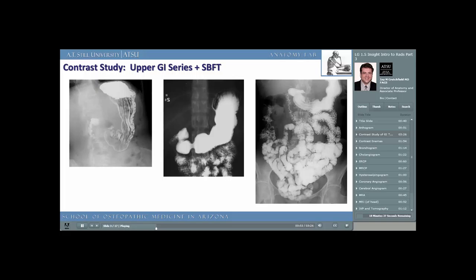Here on the left we can see the stomach and a portion of the duodenum. On the far right, we see an upper GI series with a small bowel follow-through, abbreviated SBFT. In the middle image, an upper GI is demonstrated with not only the stomach and duodenum being seen, but the proximal portions of the small intestine, notably the jejunum. There are several risk factors associated with upper GI series and small bowel follow-through studies. They are still commonly used today, giving the physician significant information on the function and pathology of the patient's internal organs, but it often does so at a price. If aspiration of barium into the lungs occurs, it can cause severe respiratory compromise and even death.